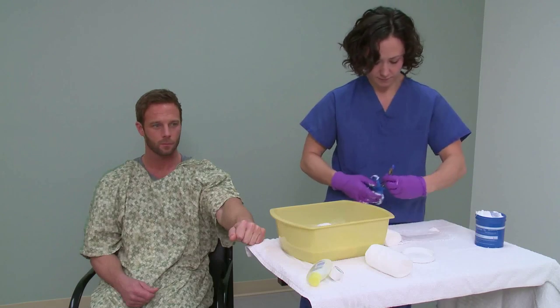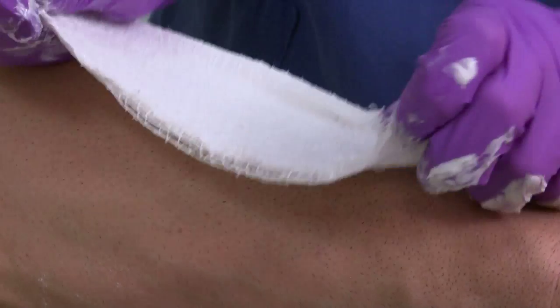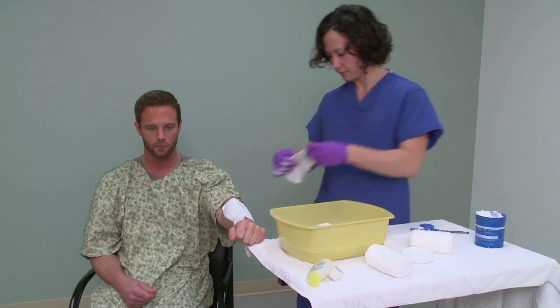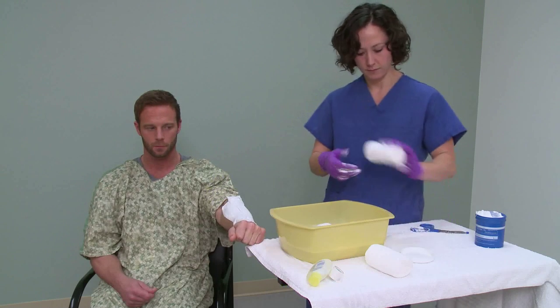Next, for applying the dressing, cut appropriate length strips of Sylvadine-coated gauze to cover your burns. Apply to your clean burns. Try to limit application on healthy skin. Allow some overlap — about an inch — onto healthy skin, expecting that your dressing will shift as you move about.